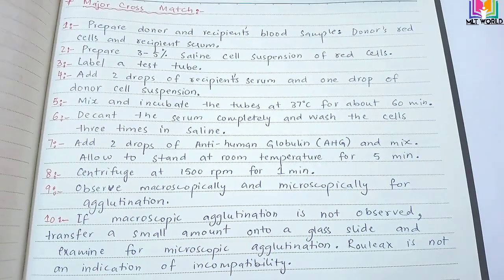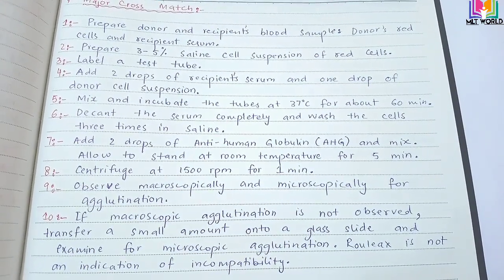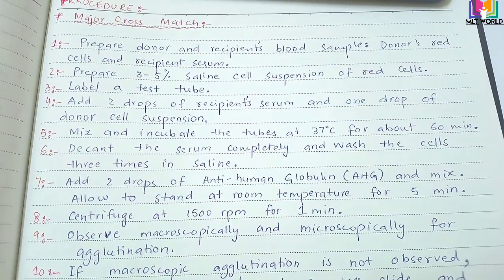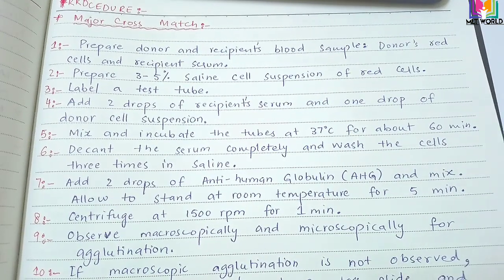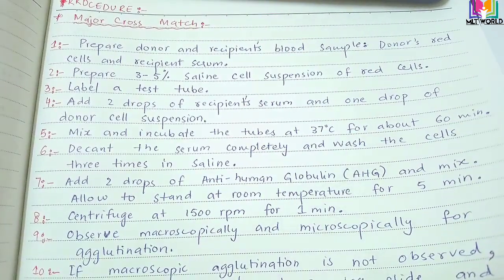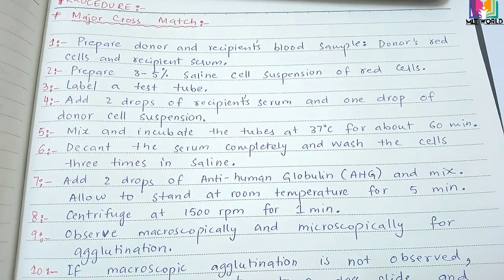Then we will keep it at room temperature and allow it to stand for 5 minutes. After that we will centrifuge that tube at 1500 rpm for 1 minute, and then we will observe the tube macroscopically and microscopically for agglutination.